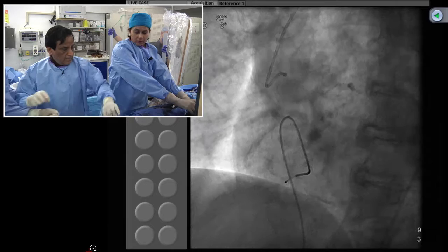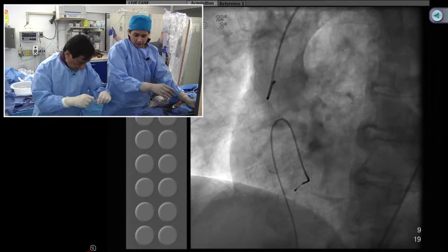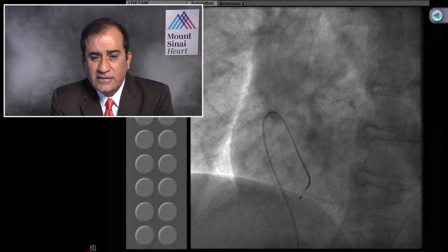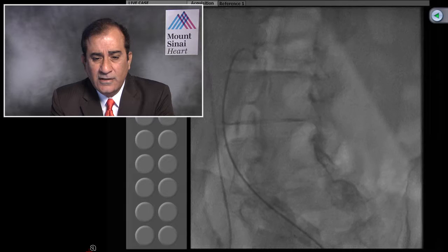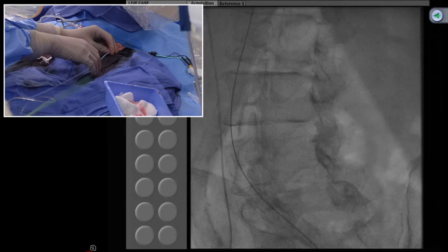It looks like just a little whiff — nothing significant. Very elegantly performed. The statement is: do not be overtly aggressive, and reducing the gradient to half sounds like a good yardstick.